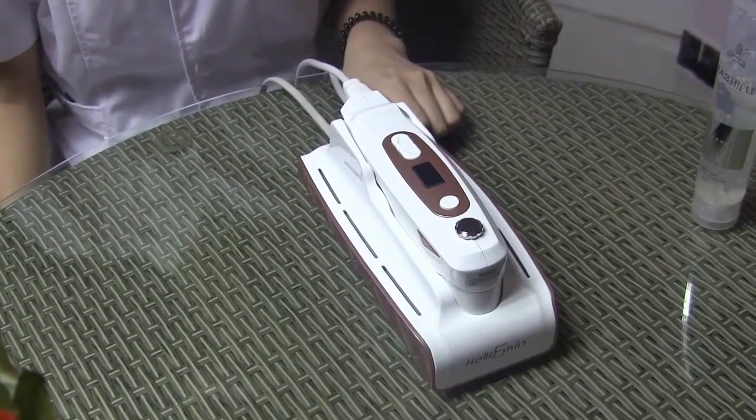Okay, now let's see how to operate the HelloSkin. Firstly, you need to clean your skin. When you have makeup on, you need to use the makeup remover oil to remove your makeup. And then put some oil on the treatment area. And for the cheeks, we're using 4.5. When the depth and energy are adjusted, you can start working.